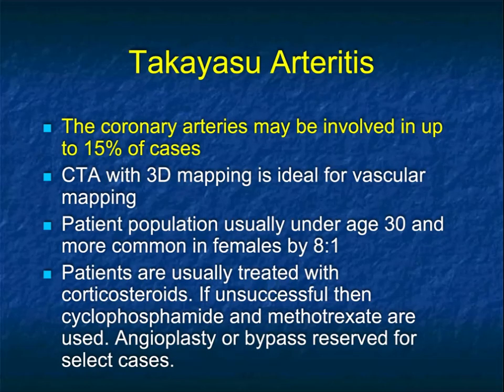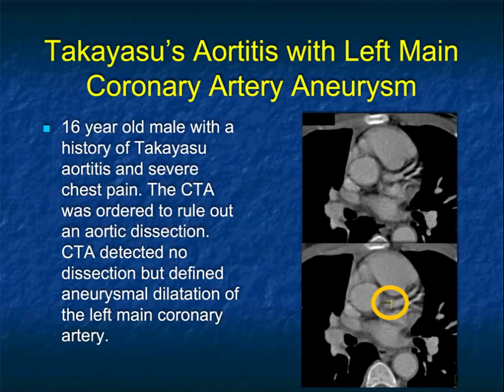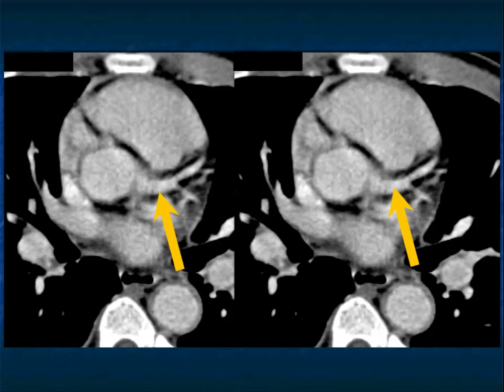With Takayasu's, up to 15% of cases can involve the coronary arteries. The disease typically occurs under age 40 — often under age 30 — predominantly in females by a seven-to-eight-to-one ratio, and patients are usually treated with corticosteroids; early intervention can change the course of disease. Here's a patient with chest pain showing an aneurysm of the left main coronary artery — no dissection — and you can see the thickening of the left main coronary artery due to the primary disease process.